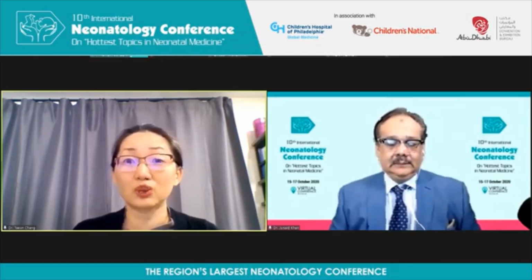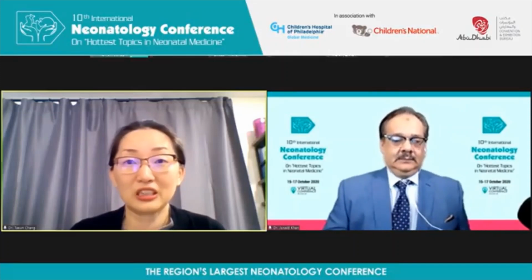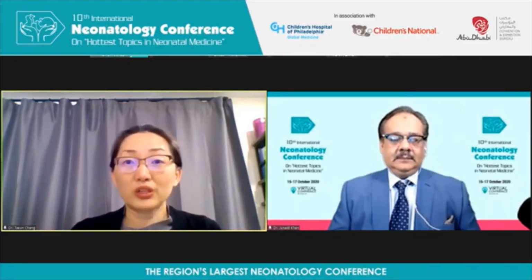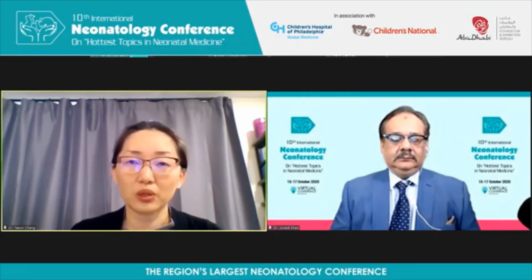difficult issue with the extreme preemies, or even any preemie, is that they can have myoclonic jerks as part of their sleep phenomenon. It is very hard to discern if those are sleep myoclonus versus seizures, because myoclonic epilepsy can have very little EEG signature as well, because the actual seizure is so brief that you don't capture any EEG changes. And so I hesitate to just treat myoclonic jerks in the preemie by throwing seizure medications on them.